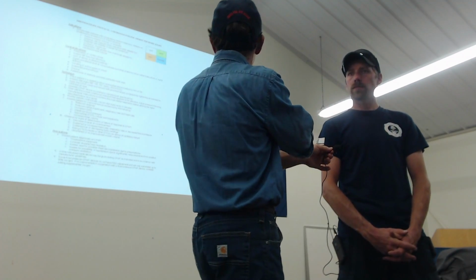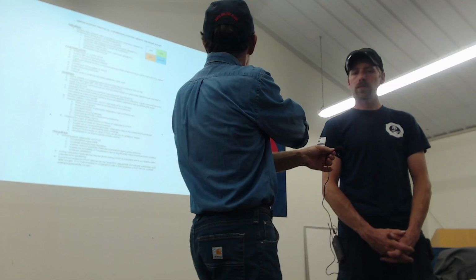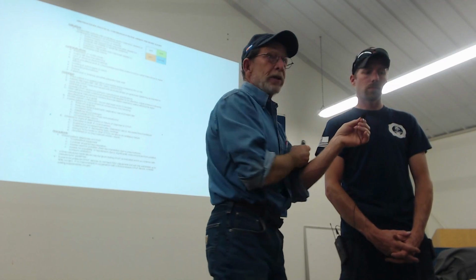It definitely made his comfort level go way up, which decreased his stress, and then all his vitals leveled out. And a reminder, the protocol will remind you all that it's an EMT basic, EMT intermediate, and paramedic skill. So this is a BLS skill. We really want all BLS and ALS providers to feel comfortable with it, know how it works, and think about reaching for it early rather than late. It can really help us. It reduces the need for an invasive airway by a bunch, and it helps people survive longer.